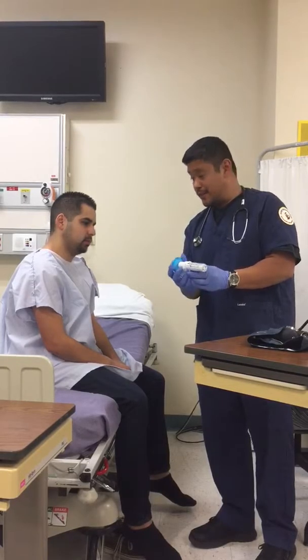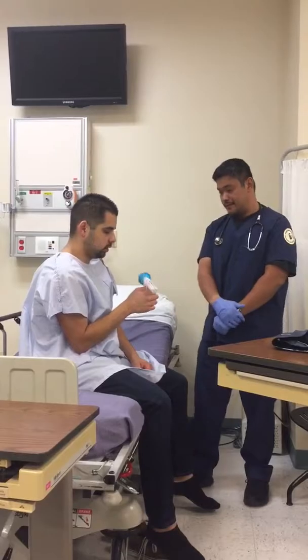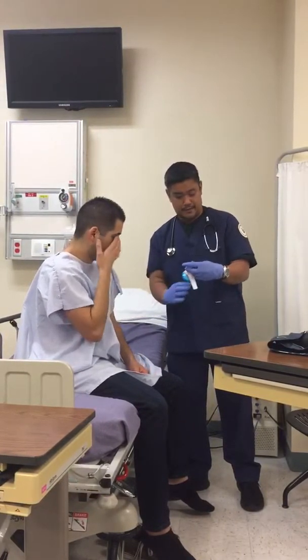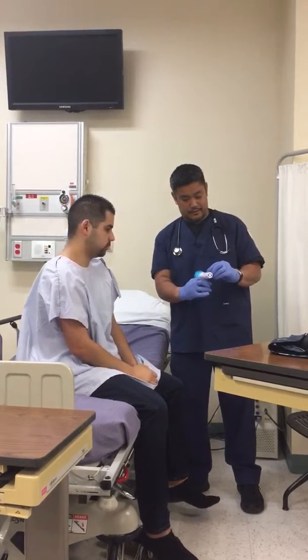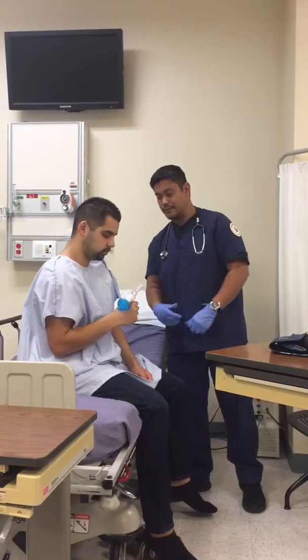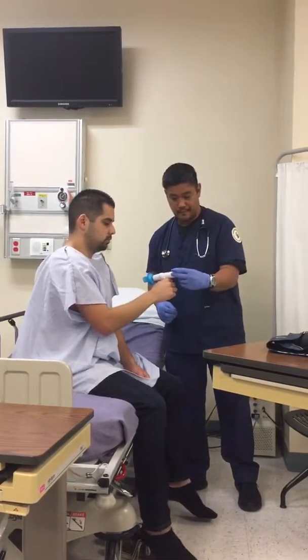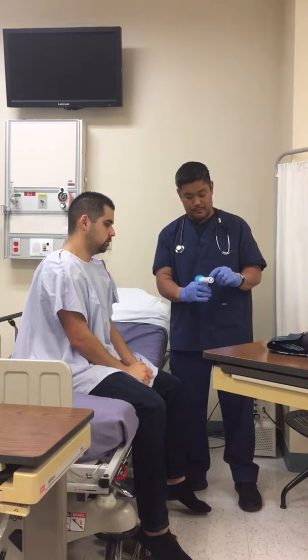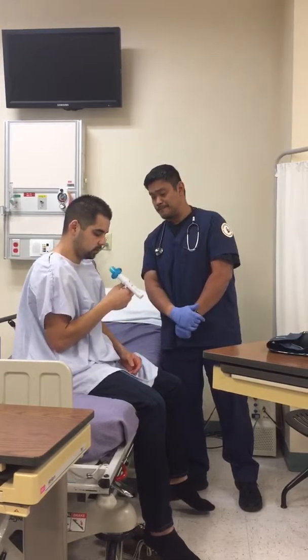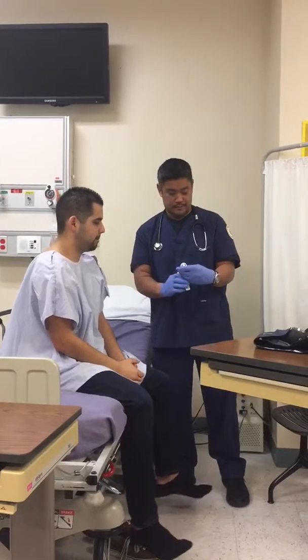So we're doing it 3 times. Go ahead and do it for me right now. Take a deep breath and blow out. Great job. And if you do that once more here. Good job. All right, one more time. Make it the best, all right? Deep breath and then blow as fast as you can. Wow, great job.